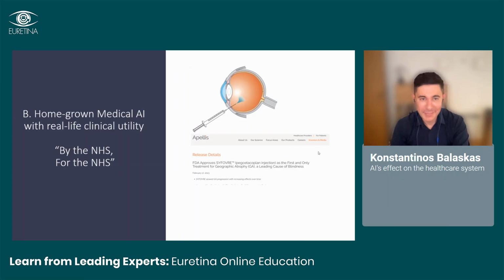We can move to the next slide. And now, focusing on geographic atrophy, as Ursula very nicely summarized in her presentation, geographic atrophy is now our new main focus of interest. And it is where AI will probably shine, because in neovascular AMD, we can eyeball, in a sense, the changes in fluid, in pathological features, and make management decisions.